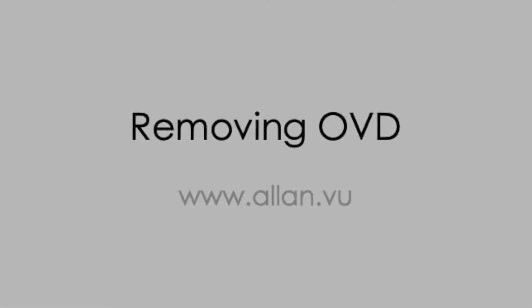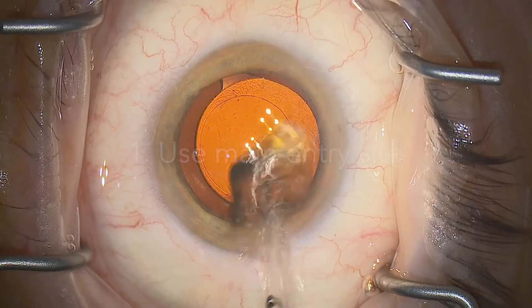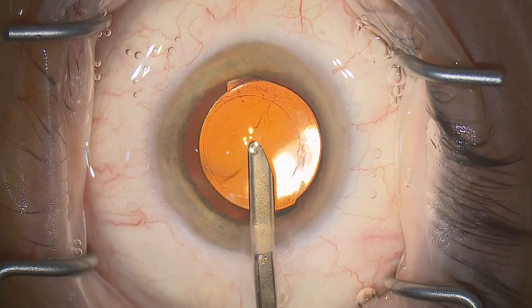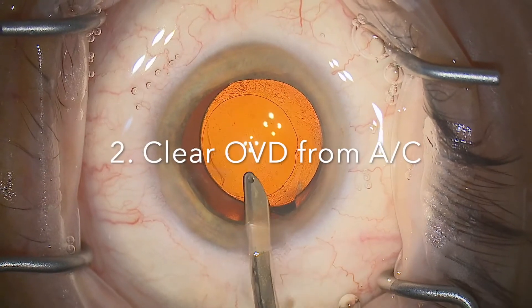Here we're going to walk through three key points on viscoelastic removal after intraocular lens insertion. Step one is to aspirate through the main entry site rather than through either of the paracenteses. This allows washout around the IA cannula and avoids an uncomfortable pressure rise in the eye.